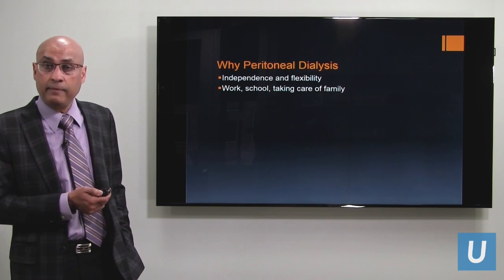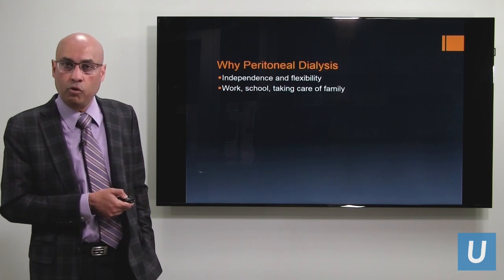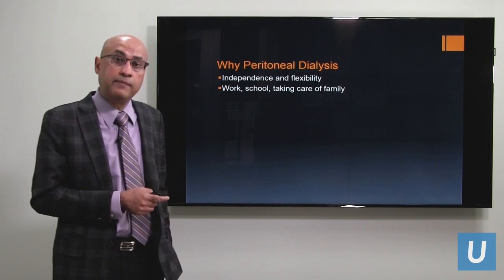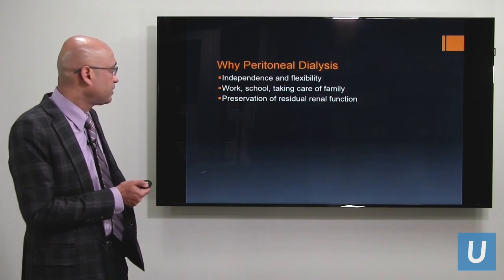Some need to take care of their family. So all of these things become possible because you're dialyzing at home, and also dialyzing at night, especially if you're on a cycler. Like I said, you hook yourself up to the dialysis machine, let it do its job, and then in the morning you disconnect.